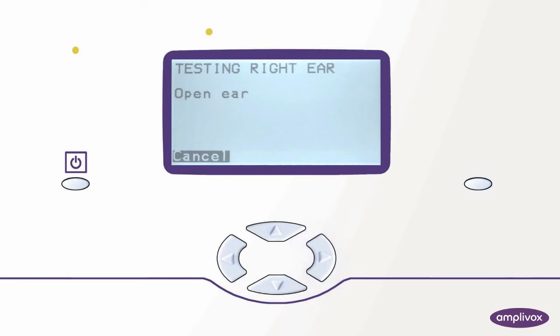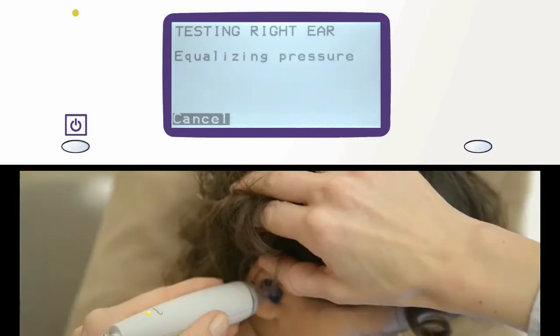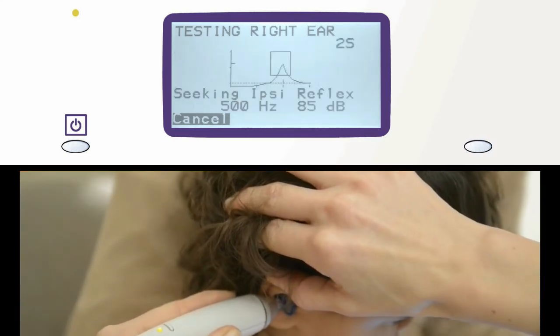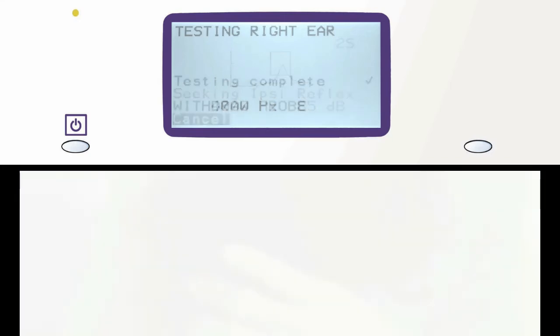Our 302 will now guide us through the test process. Insert the probe into the patient's ear and hold the probe in place while the measurement is ongoing. On the display we can follow the progress of the test sequence.